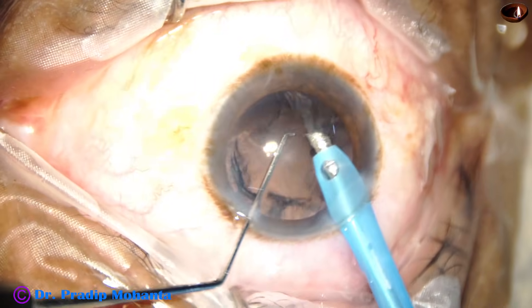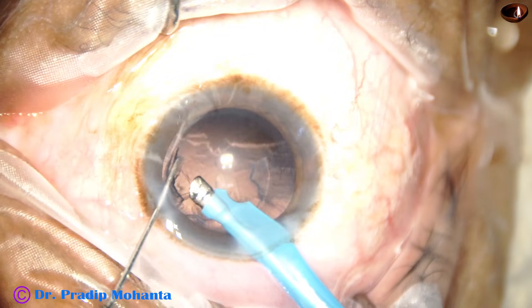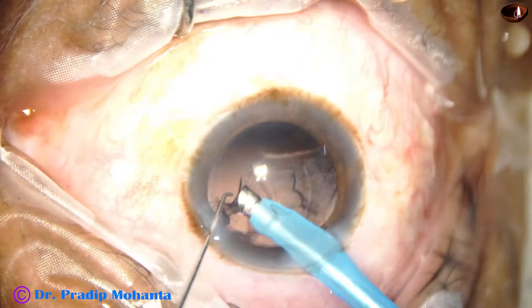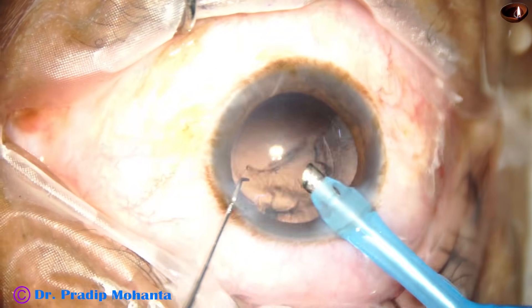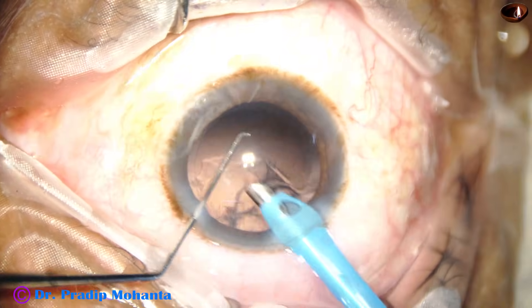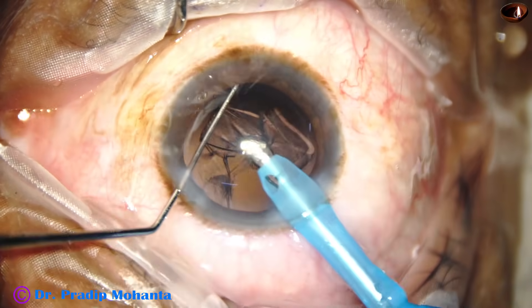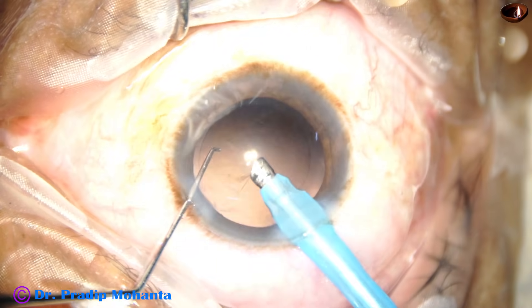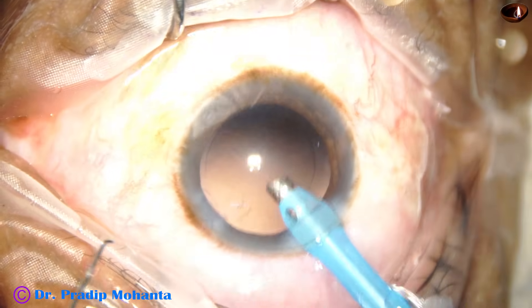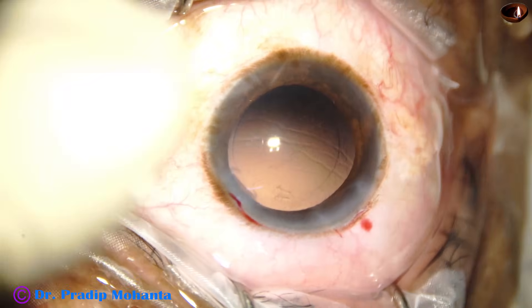Now I start removing the cortex by the handpiece itself, keeping focus on the posterior capsule. If the posterior capsule is far away, you can attempt this, but it is risky — you can opt for safer options. The cortex has been removed by the handpiece itself.